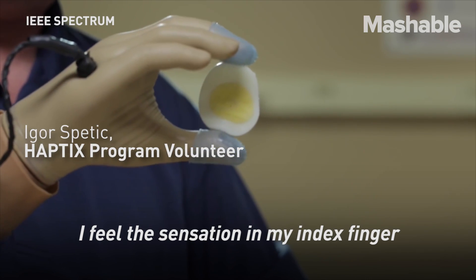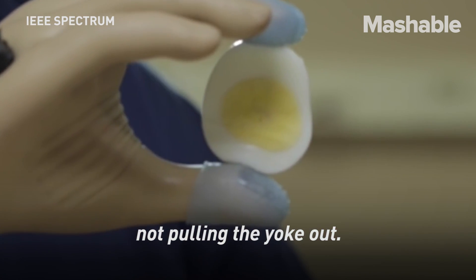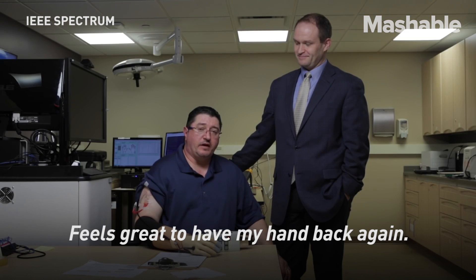I feel the sensation in my index finger and I'm holding it enough where it's not pulling the yoke out. It feels great to have my hand back again.